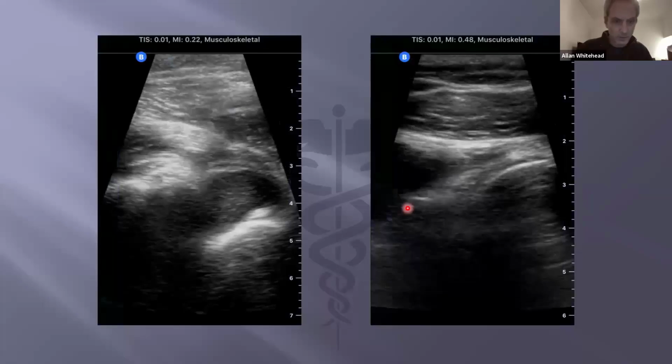Another case, more recent again, using a handheld, and this is the right shoulder coming again from posteriorly, and the glenoid lip is sitting in here. And again, you might say, could be that line, could be that line. It doesn't really matter. You can see where the humeral head is down here, and there's a good 1.5 centimeters difference between the level of whichever line there is the glenoid. I think it's that one, and the curved humeral head. And actually a really nice example of blood clot sitting in this space where the humeral head used to be.